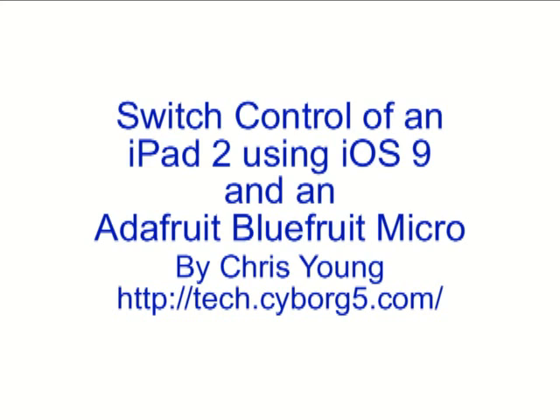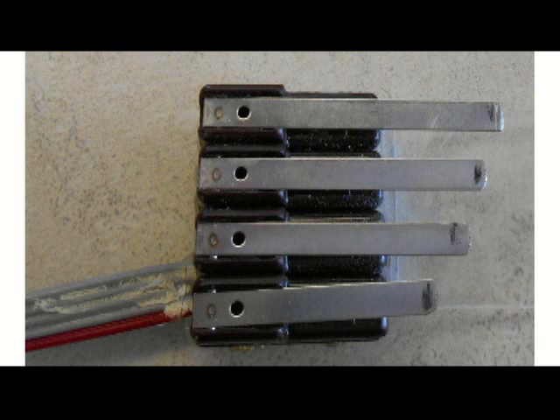Hi, this is Chris Young, and in this video I'm going to demonstrate how I controlled an iPad 2 using just 3 micro switches and an Adafruit Bluefruit Micro device. Here's a photo of the kind of micro switches that I'm using. I hold them in my right hand. This photo shows 4 buttons, but in this example I'm really only using 3 buttons.